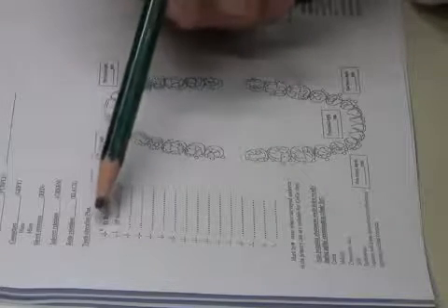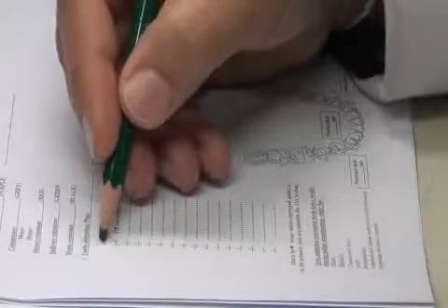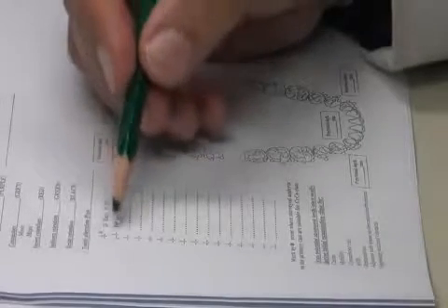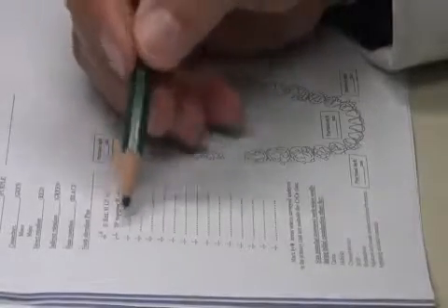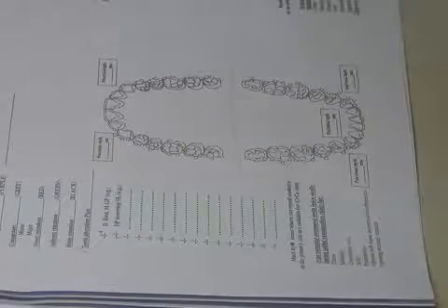For example, this is a case, distal rest, upper 6, upper right 6. Of course, this is designed in a way to have a cross. This is the cross in the middle, okay? So upper 6, we have a distal rest, and we have to prepare for a mesial guide plane. Some teeth you need distal lowering of, for example, distopalatally, you need to lower the survey line, okay? So these are types of preparation and how you write them.